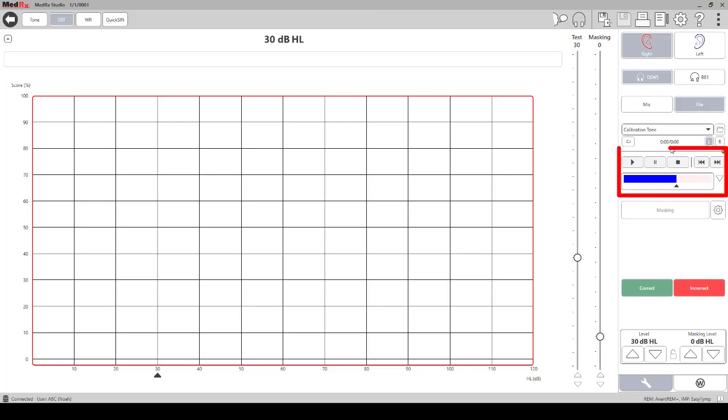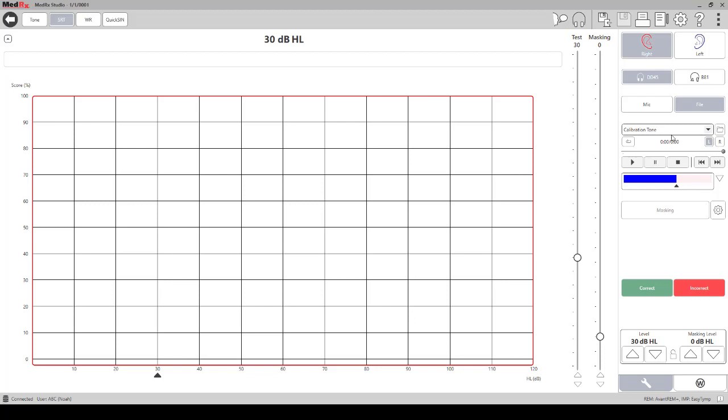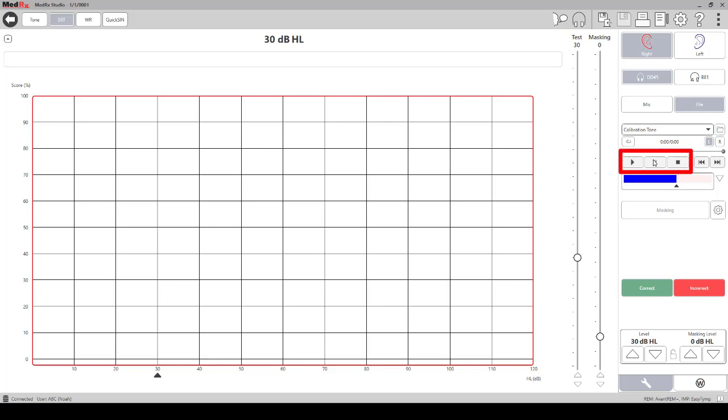The media player just below these options will run the sound files continuously like a CD player would. To play the files this way and to access the built-in word list, click on the file folder to the right. The play, pause, and stop icons will allow you to run the speech files continuously like a CD player or to use your own CDs if you have a preference.